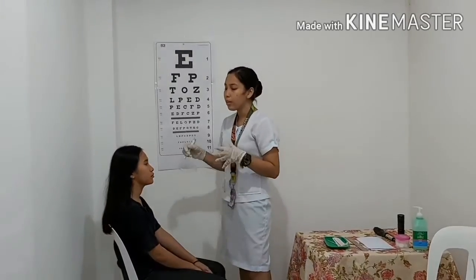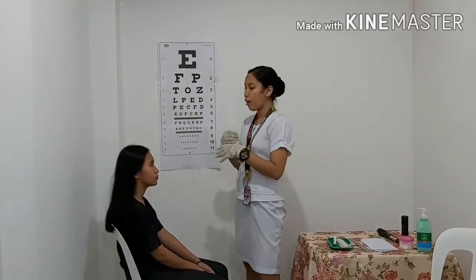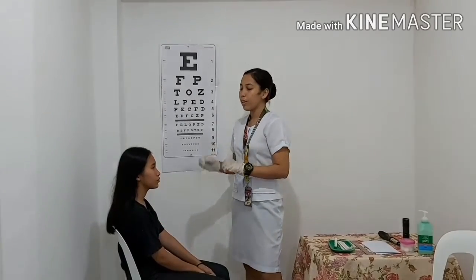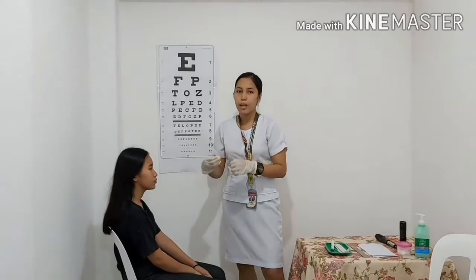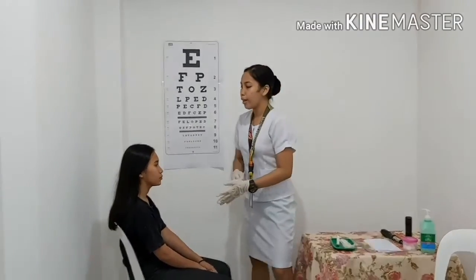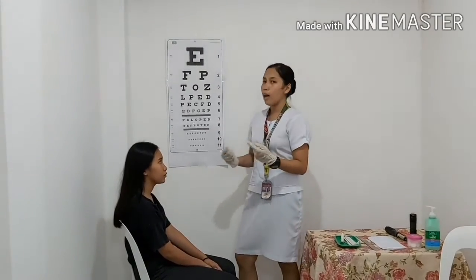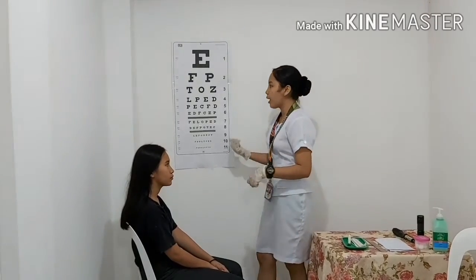So the pupil doesn't have any misalignment or change of position. It only follows the reflection of the light. And lastly is to assess the visual acuity of the client. For this, we need to use the Snellen chart.